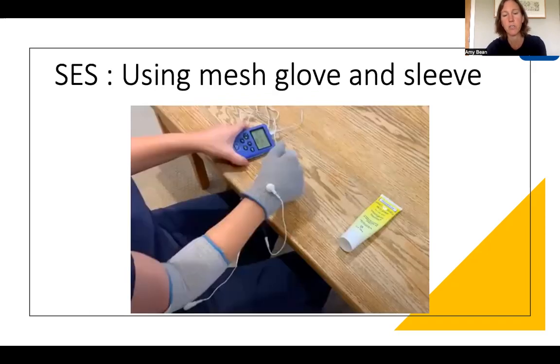This is a snapshot of a sensory stimulation setup. We've got an electro mesh glove on the hand and an electro mesh sleeve on the arm. We'd use a conductive cream underneath both garments, just like you would have sticky gel to the back of an electrode. It's hooked up to a preset sensory stimulation program on our StimPro.